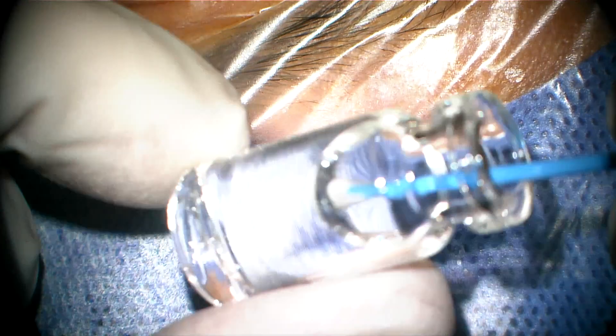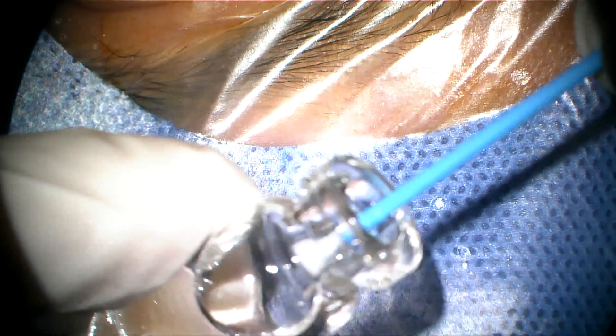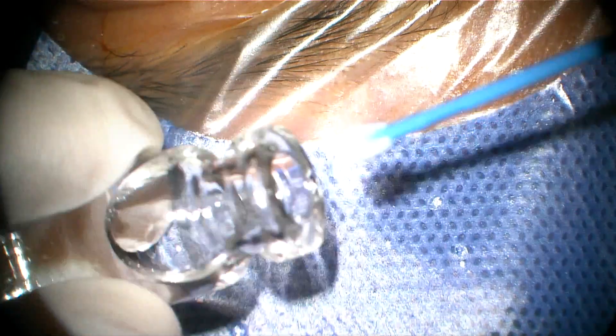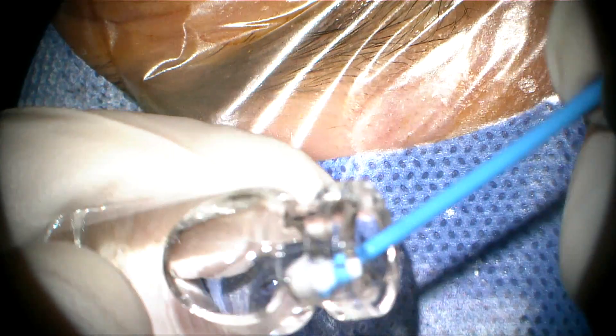This is a case of phakic IOL implantation. Phakic IOLs can be divided into posterior chamber IOL or anterior chamber IOL. Anterior chamber can be further stratified into iris claw or angle-supported. The angle-supported lens has been withdrawn from the market due to endothelial decompensation typically caused by this type of lens.